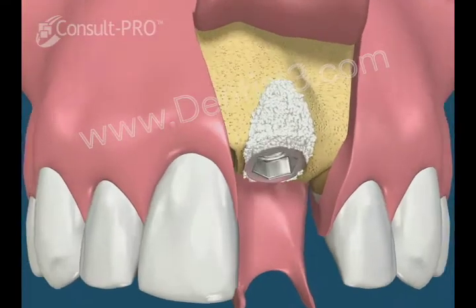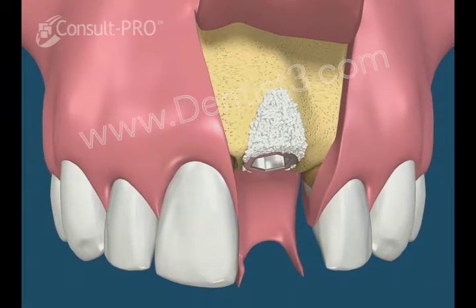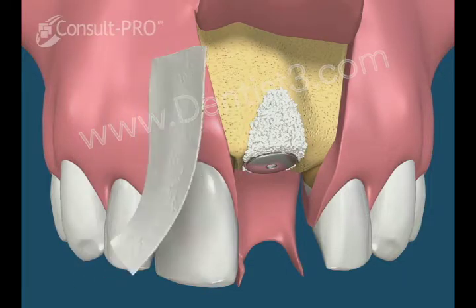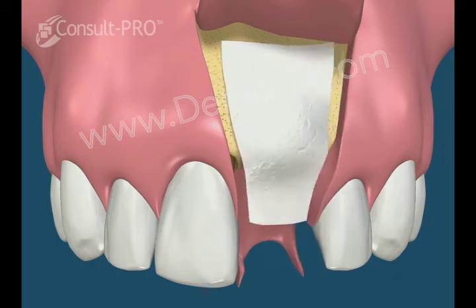Bone or bone substitute from various sources can be placed in the defect. The cover screw is inserted into the implant to cover the internal threads, and a resorbable membrane can be used to cover the area to help with healing.